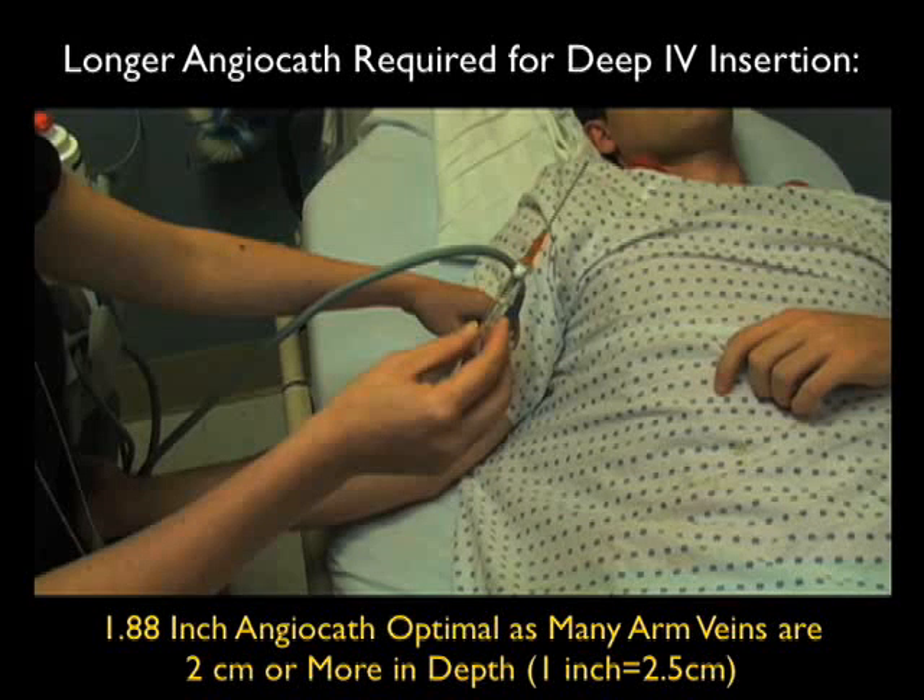To reinforce the point that we need a longer angiocath for these deep peripheral IV insertion attempts under ultrasound guidance: here's a 1.88 inch angiocath that would be great for peripheral IV insertion. We're going down about 2 centimeters or more in depth to access these ultrasound guided IVs. Remember that 1 inch equals 2.5 centimeters. We need enough of the plastic part of the catheter within the vein lumen so as not to have extravasation of fluid.